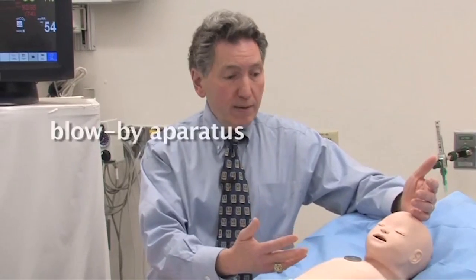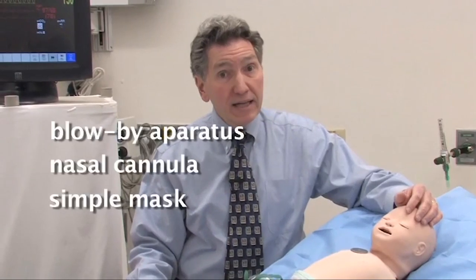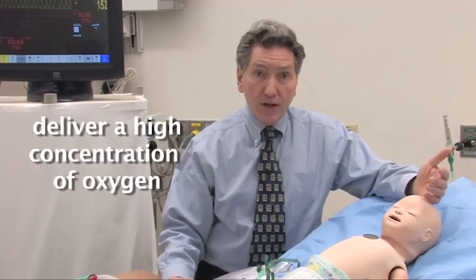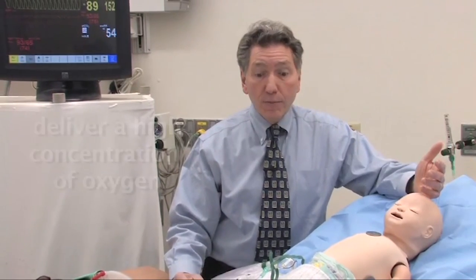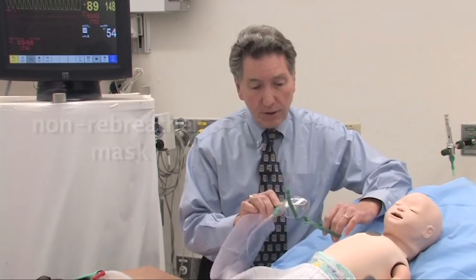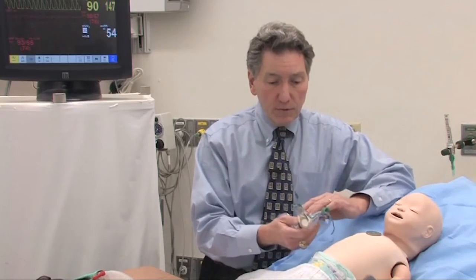The baby who's in respiratory distress will be breathing fast and fairly vigorously so that the gas flow going in and out of their nose will be high. You can supply oxygen with a simple blow-by apparatus — just a hose, a nasal cannula, a simple mask — and that will give the baby oxygen, but the baby will also probably be entraining some room air. One of the ways to deliver a high concentration of oxygen and to avoid entraining room air is to use what's called a non-rebreather mask, which I have here.